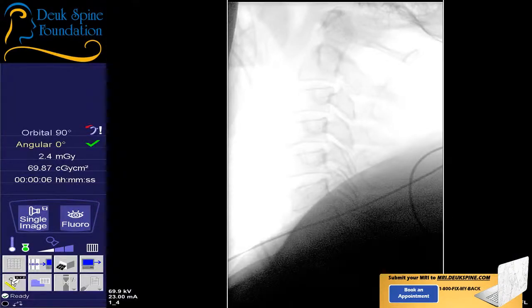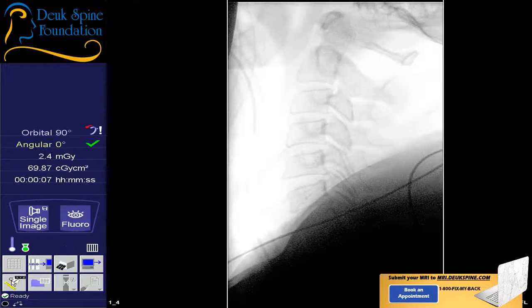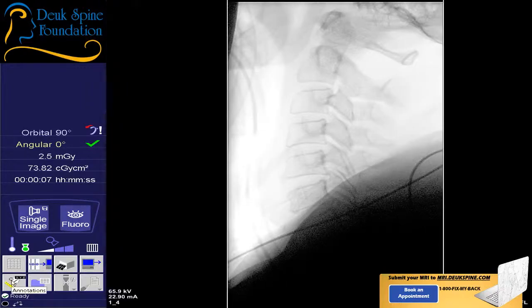All right, are we pulling on shoulders? So, I mean, we have a nice view. 2, 3, 4, 5, 6, 7. Well, you had it nicely. I guess that's okay. You're still overexposed. Either you have too much penetration or you're under contrasted on the post-processing. I don't know which it is. Even that's fine, but it's still overexposed. So either too much radiation or not enough contrast on post-processing. 2, 3, 4, 5, 6, 7. All right, well, I'll try again.